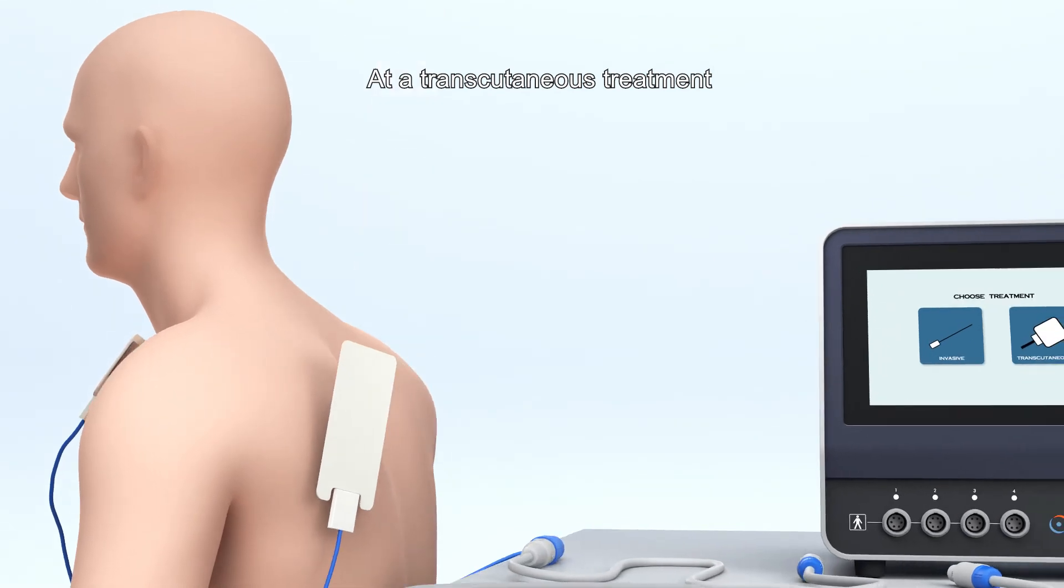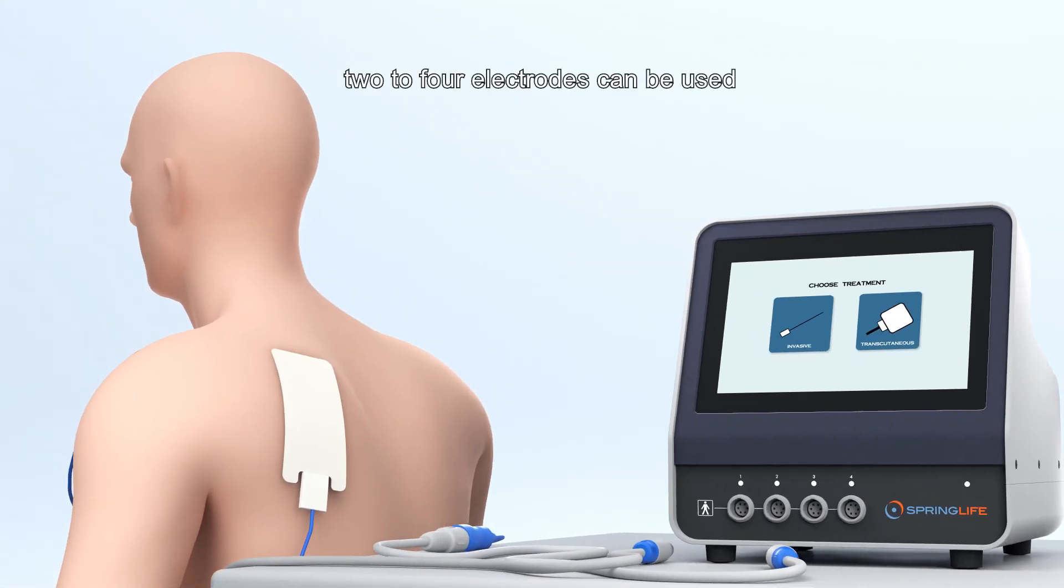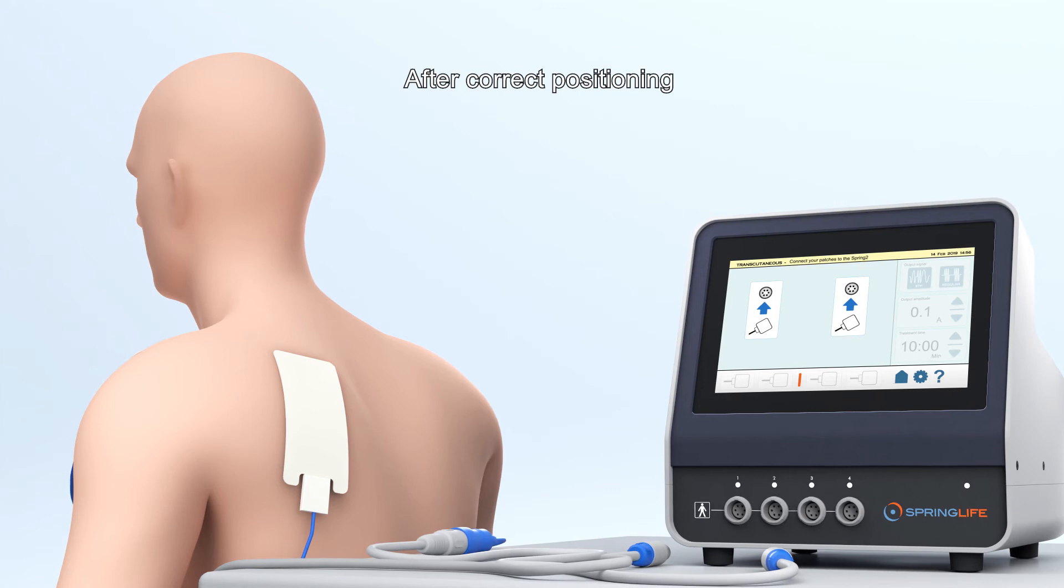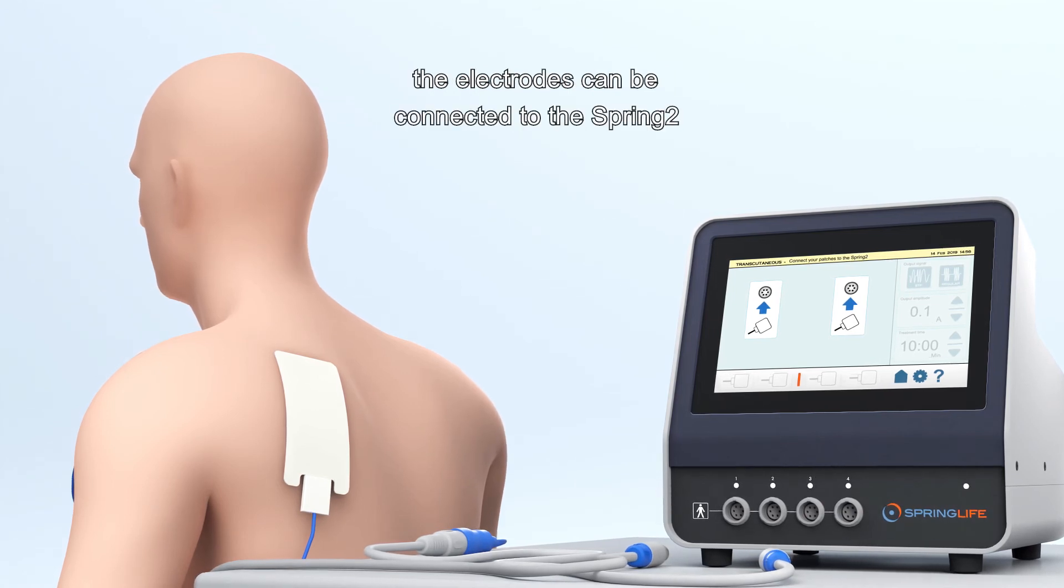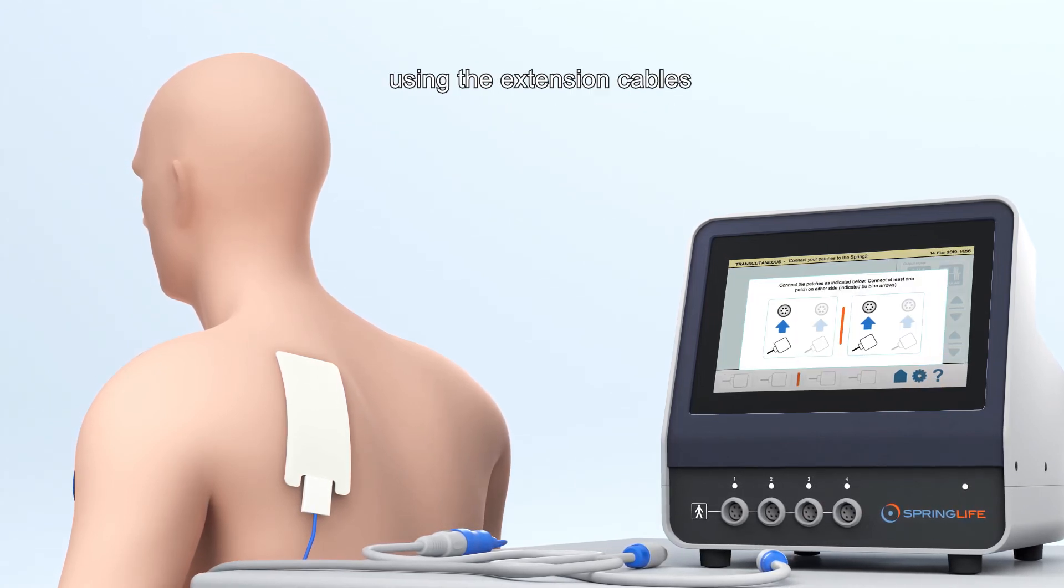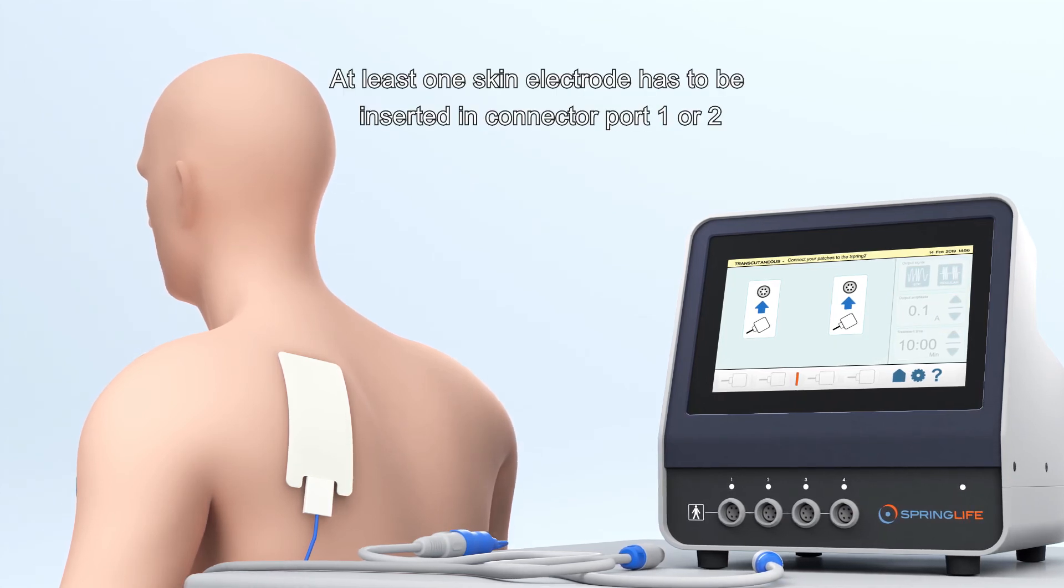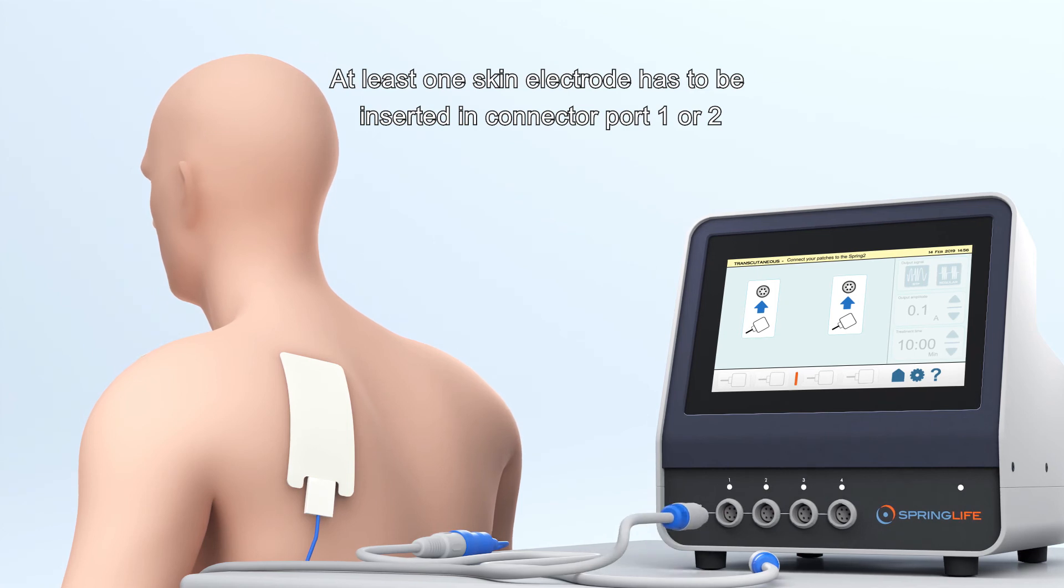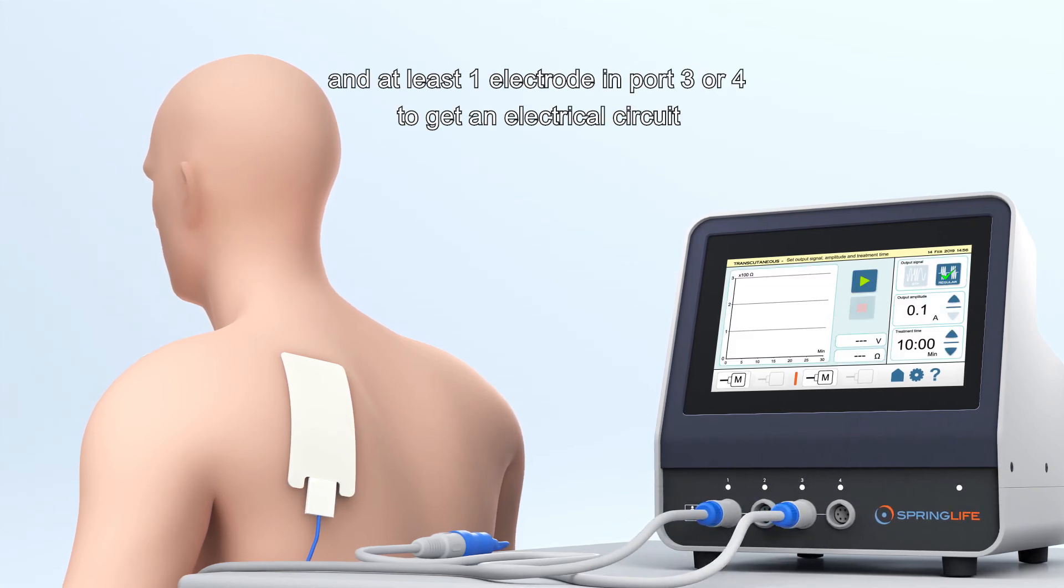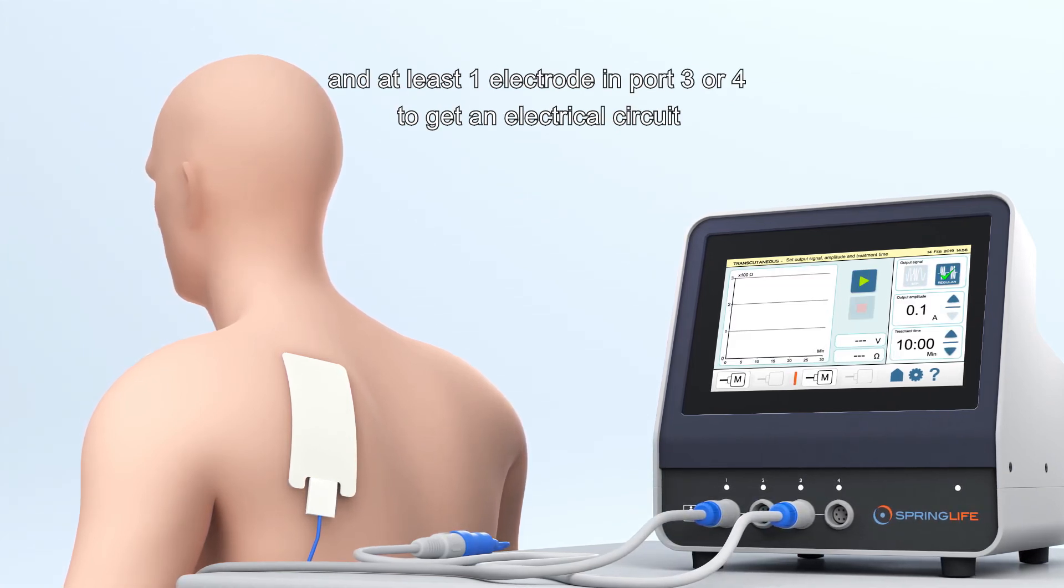At a transcutaneous treatment, two to four electrodes can be used. After correct positioning, the electrodes can be connected to the Spring 2 using the extension cables. At least one skin electrode has to be inserted in connector port 1 or 2 and at least one electrode in port 3 or 4 to get an electrical circuit.